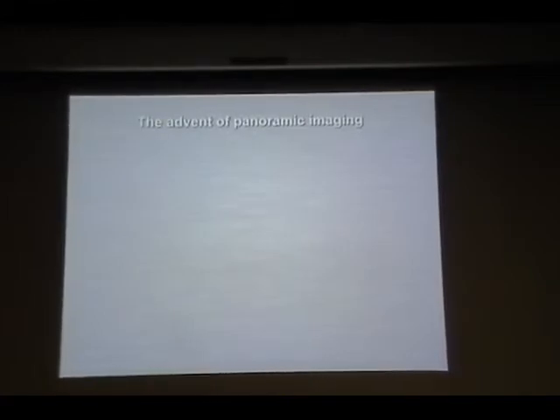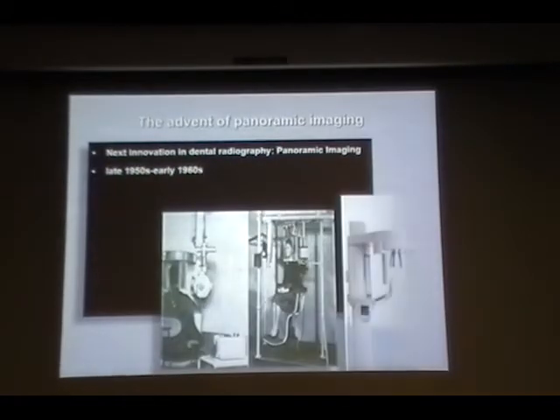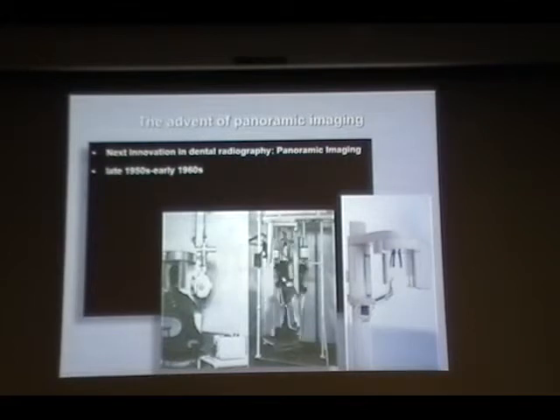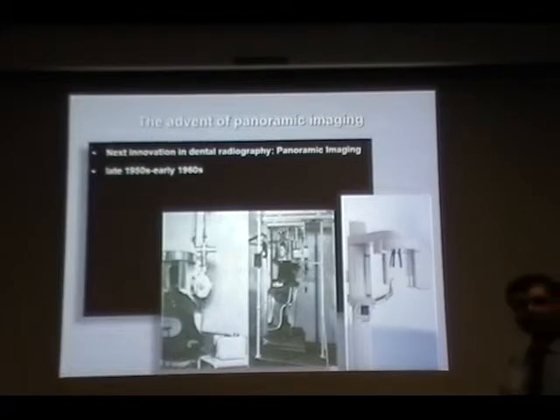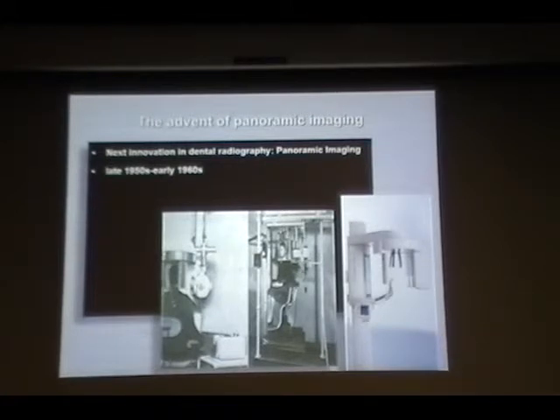And then the next advancement that came into radiology is panoramic radiographs, in the 1950s and 60s. So this is how a modern machine will look. In older machines, like here, the patient used to rotate, or the chair used to rotate, which is funny, right? Now the advancement is that the machine rotates and we get an image. It takes about 15 to 20 seconds.